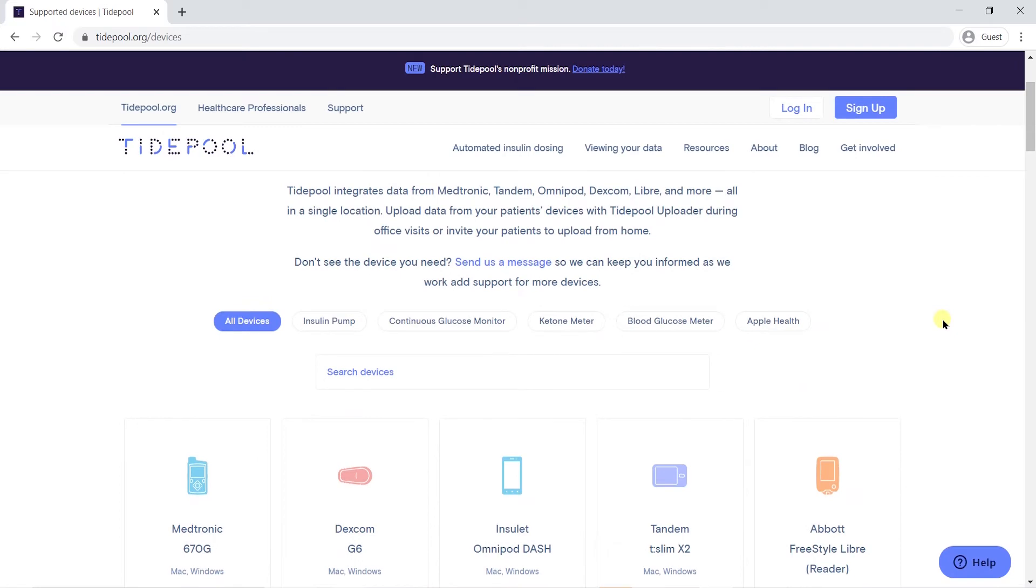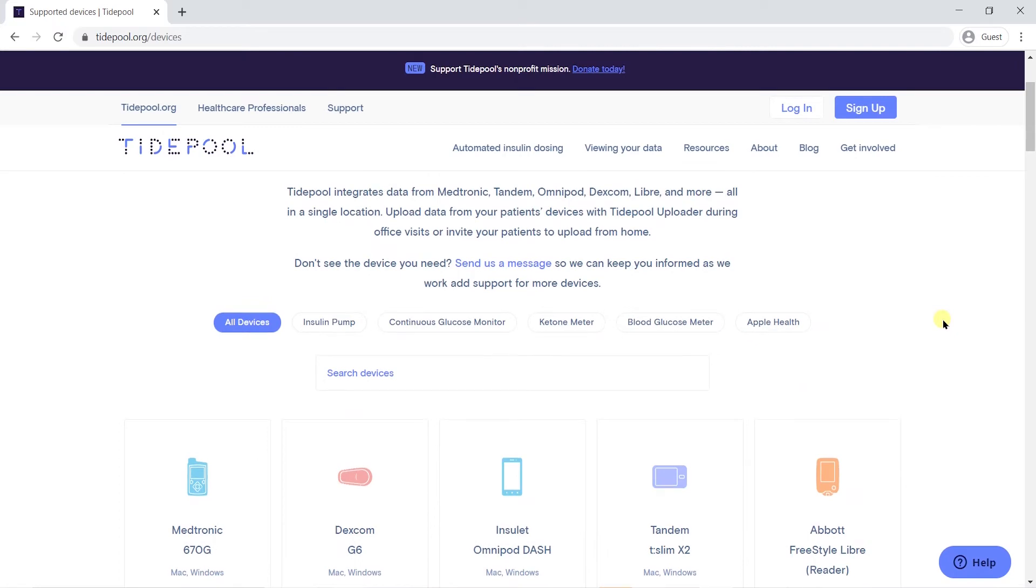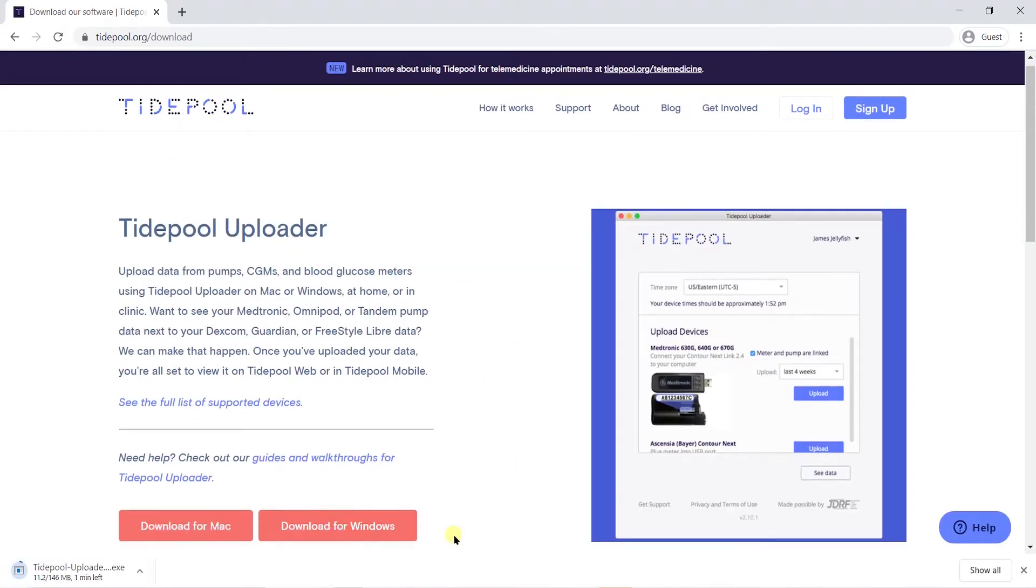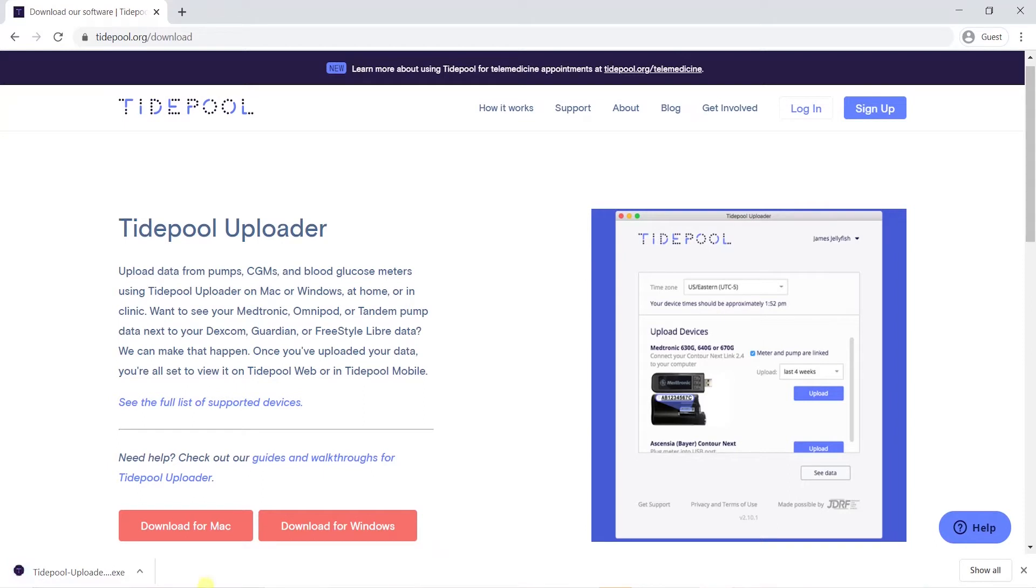Let's get started! If you are uploading your diabetes data for the first time, you can visit tidepool.org slash download to download and install Tidepool Uploader on your Mac or Windows PC.